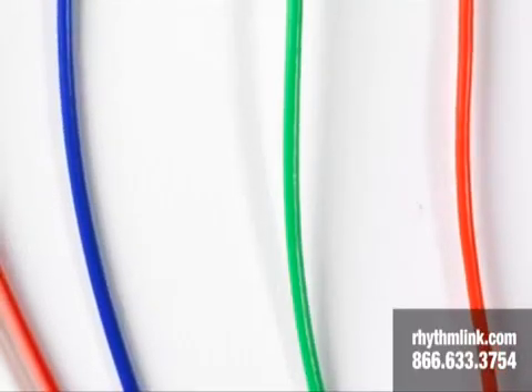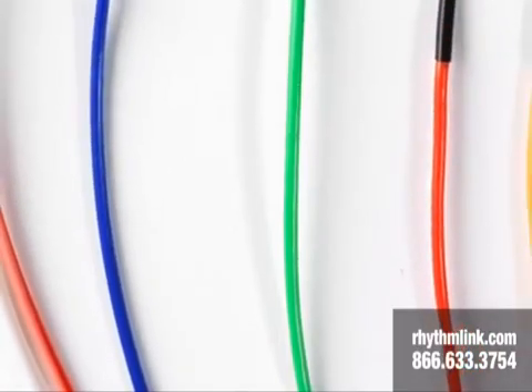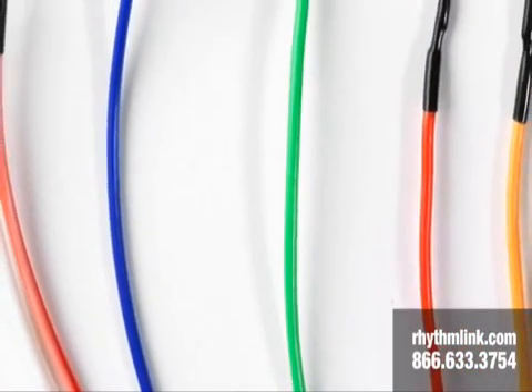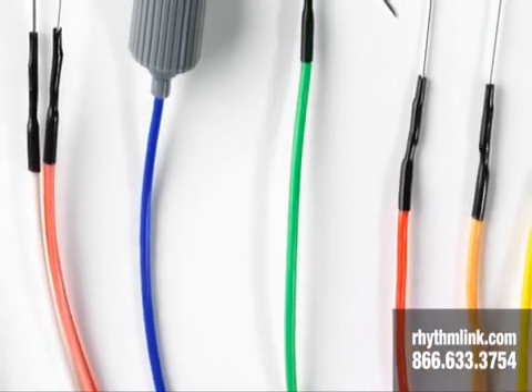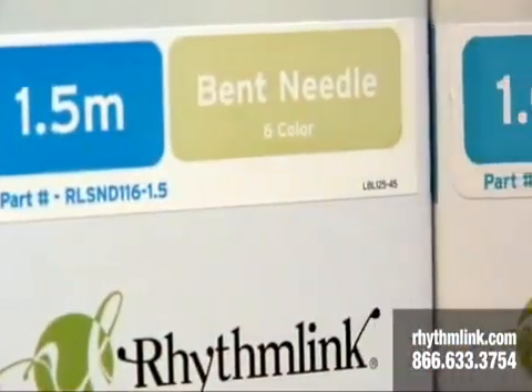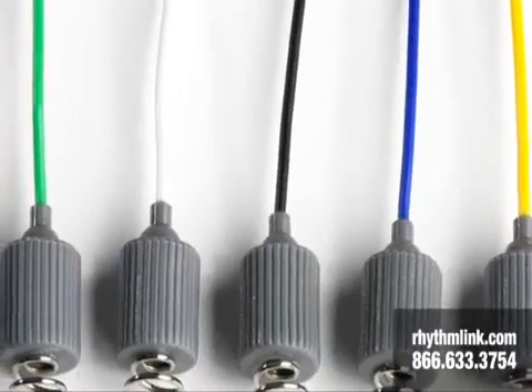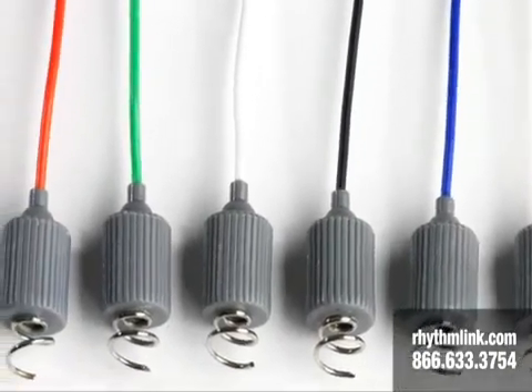In addition to our single subdermal needle electrode, we have longer subdermal needles, shorter subdermal needles, needles that are bent at a 45-degree angle, and needles that corkscrew. All of these fit different niches where customers need a specific type of product.